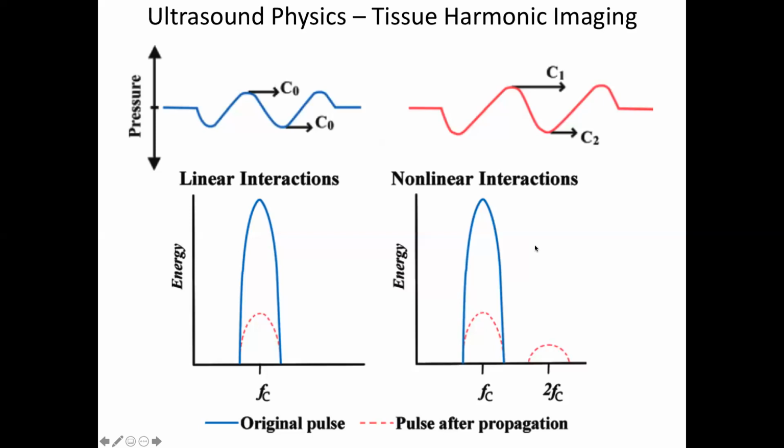Because an artifact is not random noise, right? An artifact is a process. It creates a signal you actually don't want right now, but it's an interfering process that was made by some underlying process, right?